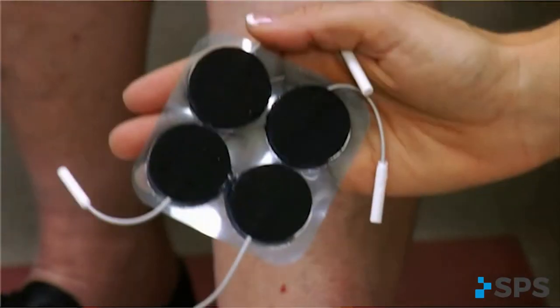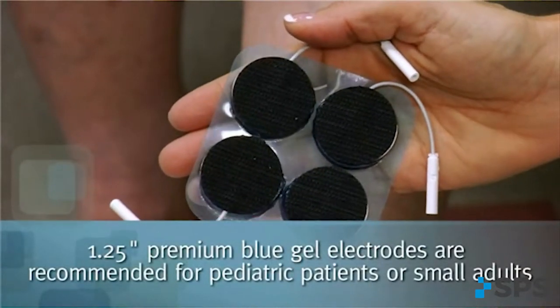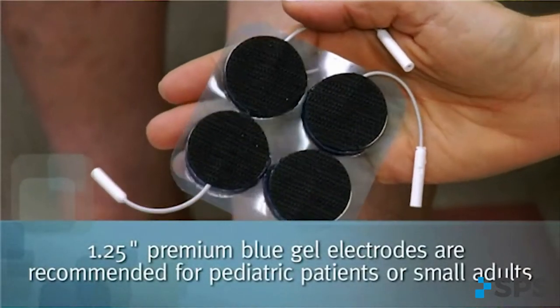Select the appropriate electrode option for your patient. The one and a quarter inch premium blue gel electrodes are most effective for specific nerve motor point stimulation. They are the recommended option for children, small adults, or anyone who gets the most effective and comfortable stimulation from an electrode covering a small, specific surface area.